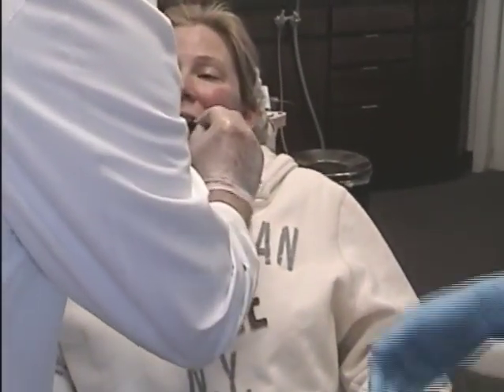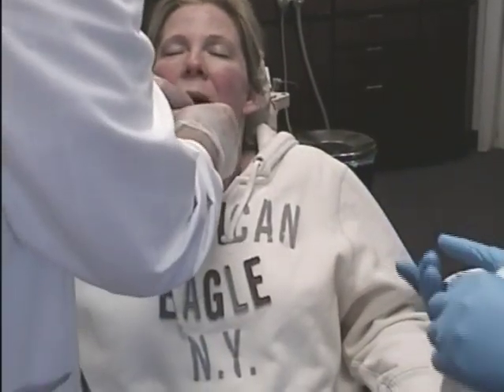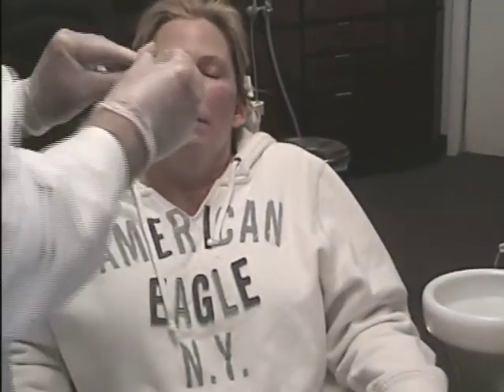I've had the patient using tongue blades in her mouth to determine what the vertical dimension is, so that I know at what vertical dimension to construct the lower splint. At this point in time, I am delivering the lower splint for the first time.